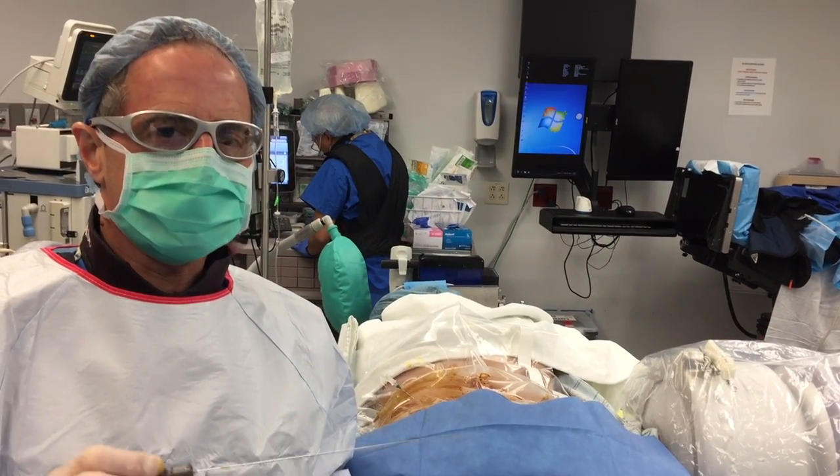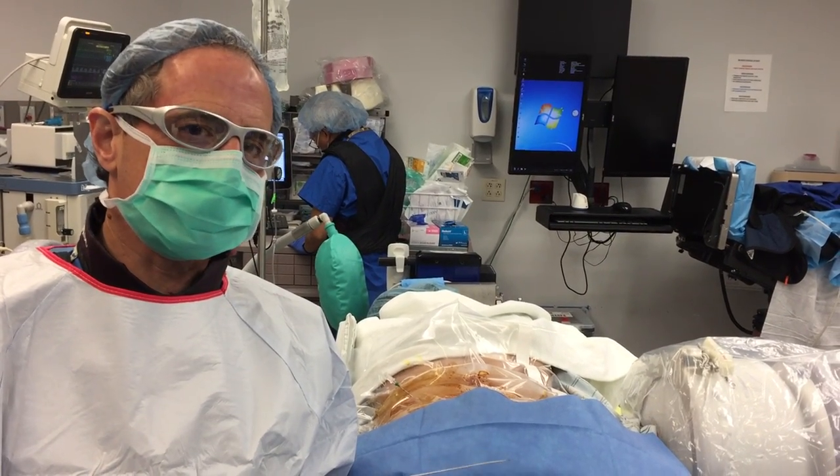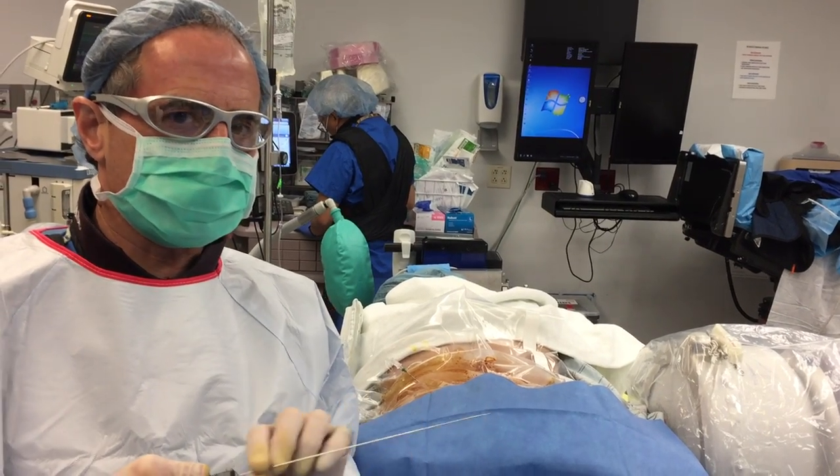Hi, Dr. Todd Koppel here. We're doing a laser percutaneous disc decompression today. This is using the ArthurCare wand.